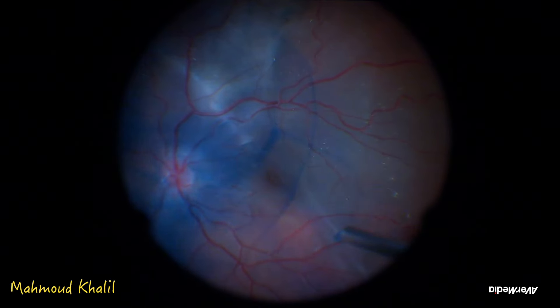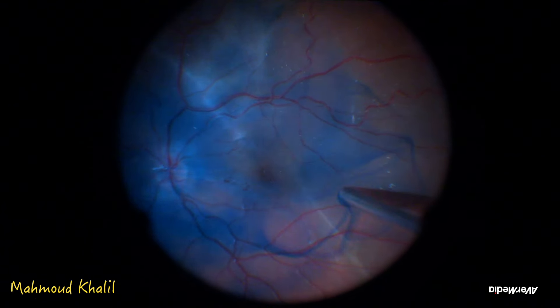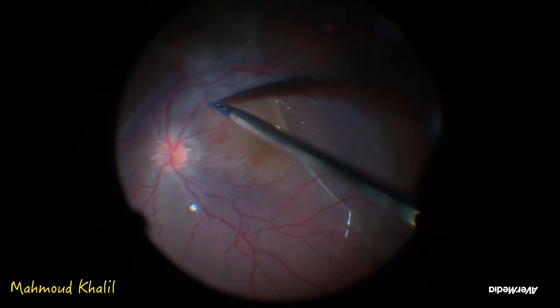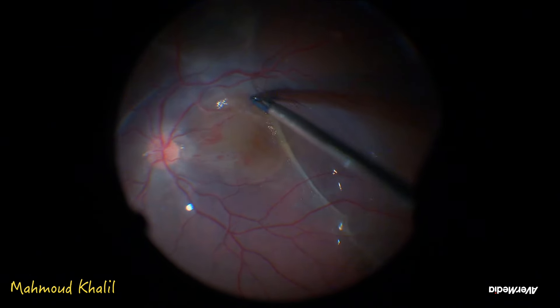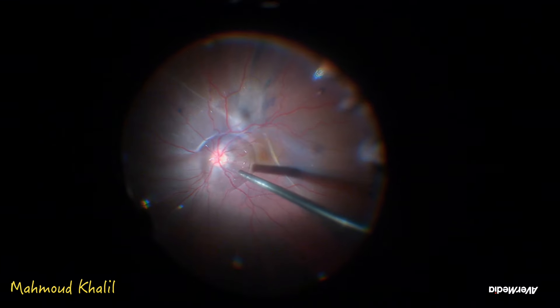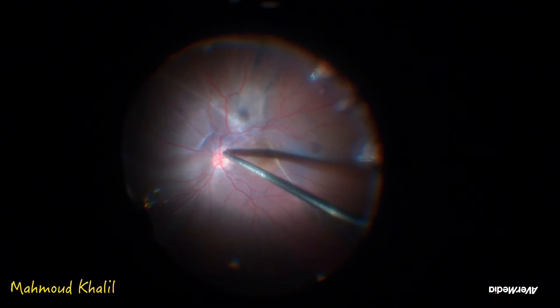As the patient was planned for 180-degree lower retinotomy, ILM peeling was done. The value of ILM peeling in such cases with large retinotomy is that there is a high incidence of epimacular membrane developing on the surface of the macula, so ILM peeling provides protection and prevention for this.